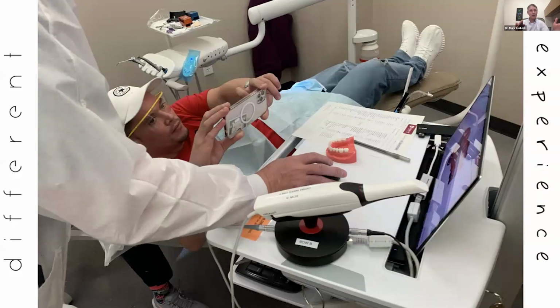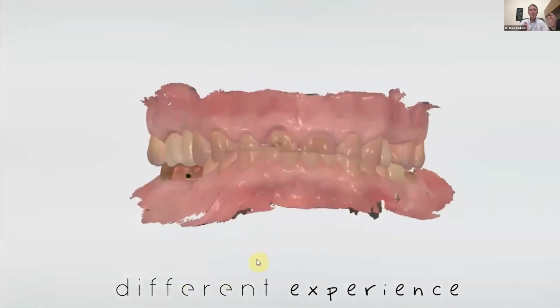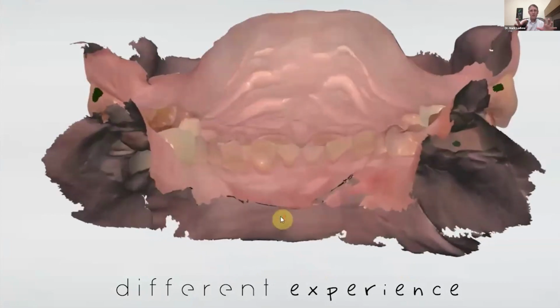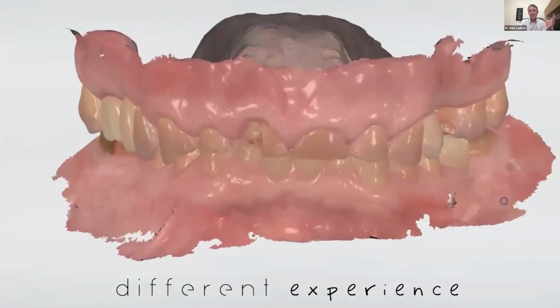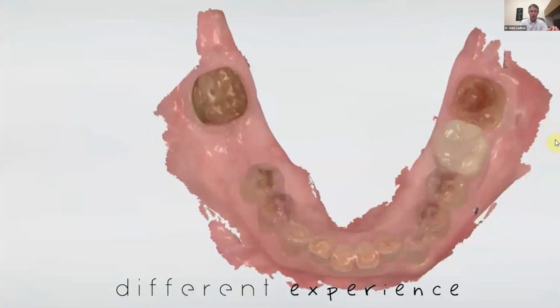And I think it's one of those things from a marketing perspective that you also need to do, because what we do with patients is we go ahead and scan them, I sit them up, and then what we do is we say, look, here's your teeth. You've probably never seen them like this before, because no one has. Even us as dentists, we've never really looked at our teeth this way. But what I do is I go ahead and zoom it in and I kind of roll it back and forth and I say, look, you've never seen it like this before. Is there anything that you see that concerns you or you have questions about? Because you've never seen your mouth actually before, ever.